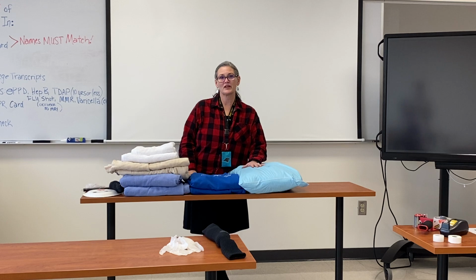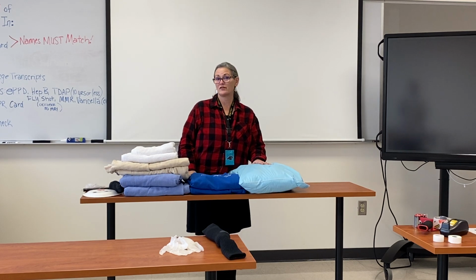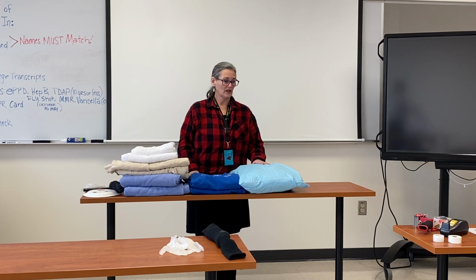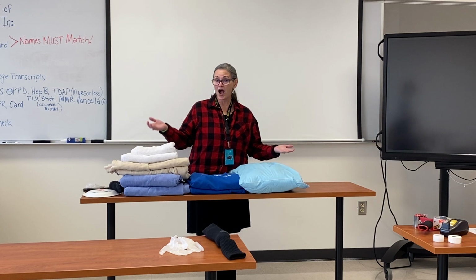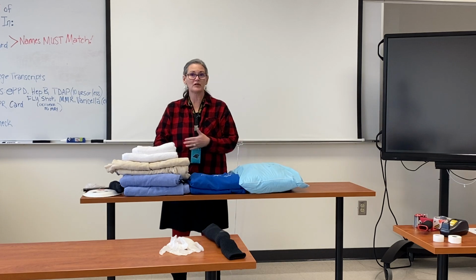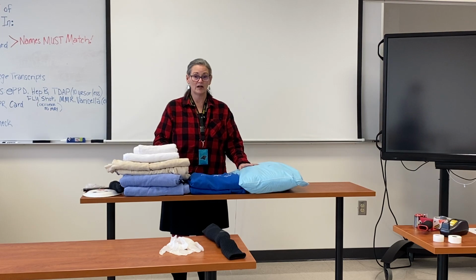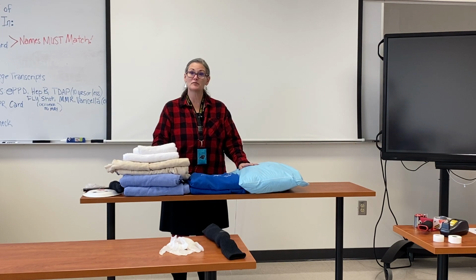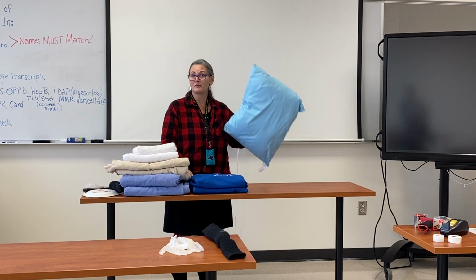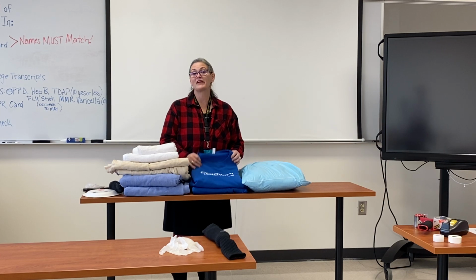My name is Mickey. I'm one of the instructors, and I would like to take this opportunity to show you that there are many ways that you can make a practice mannequin at home. And you can use stuff that you have at home when you make your mannequin. It's as simple as a couple of blankets, a couple of beach towels, and a regular bath towel. Some paper towels, a pair of gloves, a pair of socks, a set of sweats, and a pillow that's not being used. So let me start by showing you how to make your Grannykin's body.